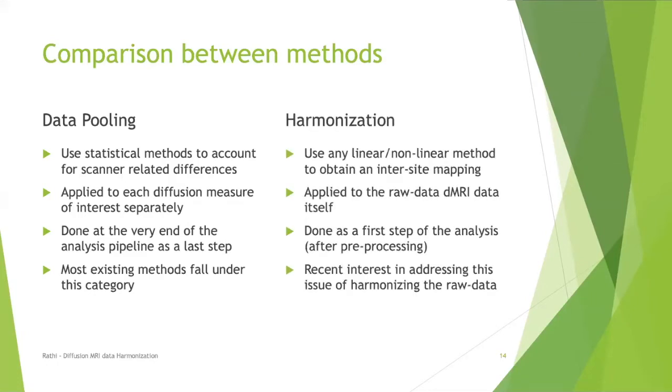On the other hand, harmonization, we think, is done at the very beginning of the pipeline after pre-processing. So it is the very first step, applied to the raw data itself. This has the advantage that you can apply any type of model to the data you want, and you don't need to worry about it. And it can be a linear or nonlinear mapping, so you can learn all the nonlinearities in the data itself when you perform the harmonization.